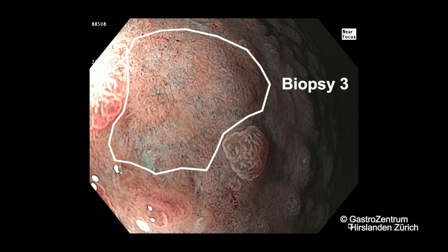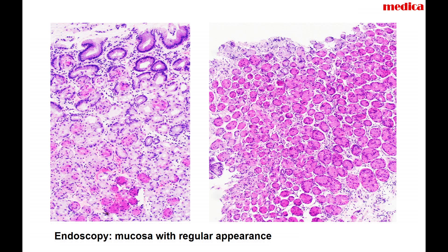We will ask the pathologist. There are some oxyntic glands and otherwise antral differentiation. You can already see here mild inflammatory lymphocytes and also some eosinophilic cells. This basically shows absolutely inconspicuous oxyntic mucosa.